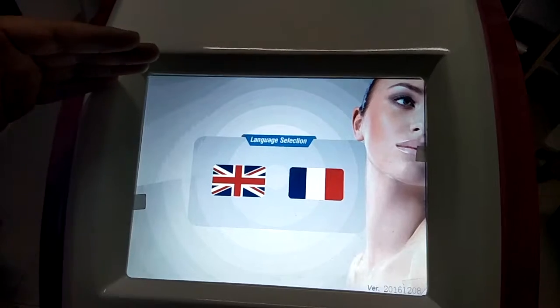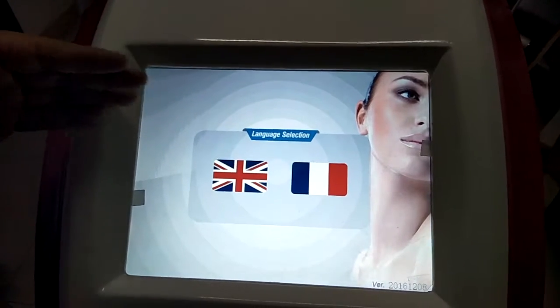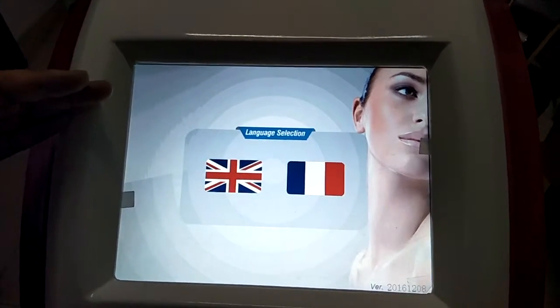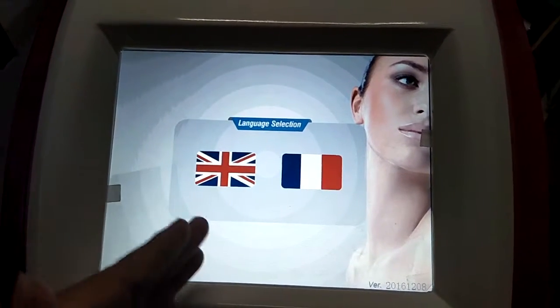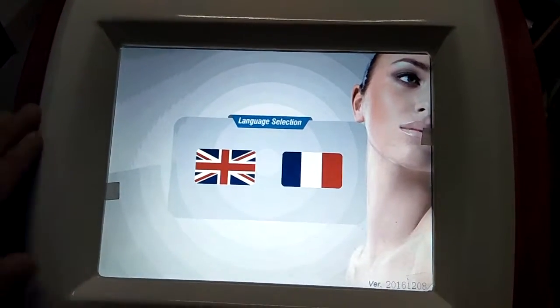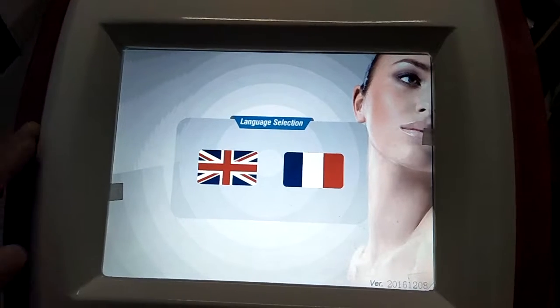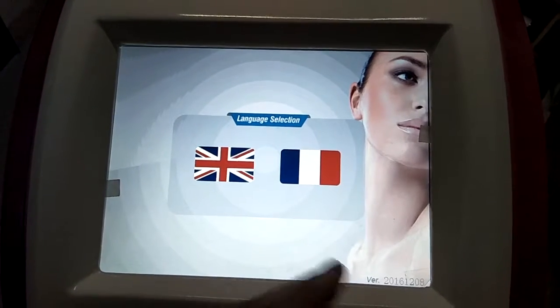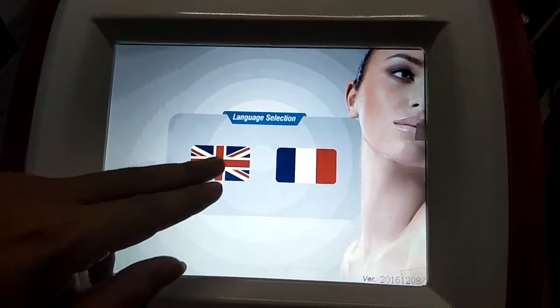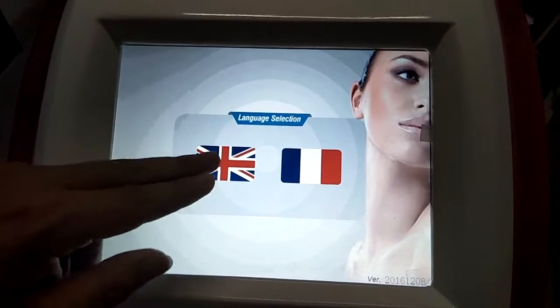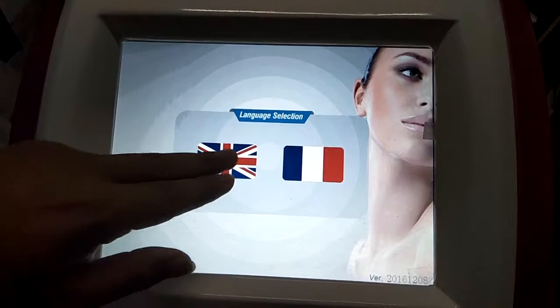Here is the language selection. We can choose the language — English or French. Any other language we can also make. For example, we can choose English.